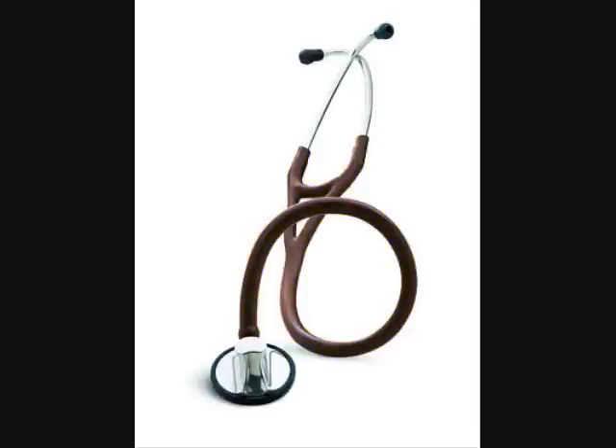Additionally, the stetoscope comes with a special procedures adapter for difficult sight or pediatric auscultation.